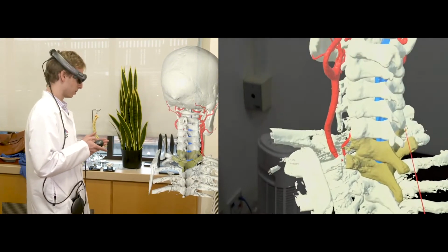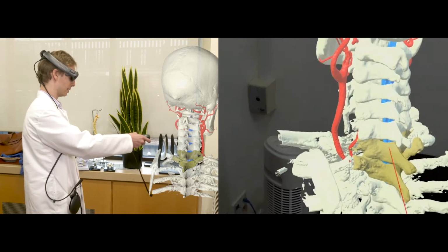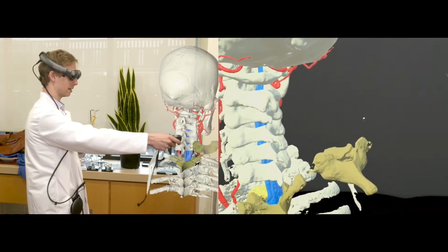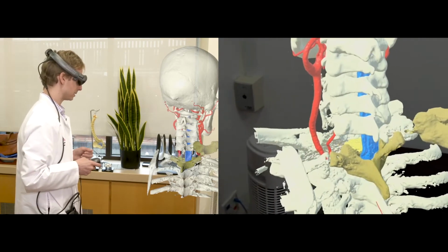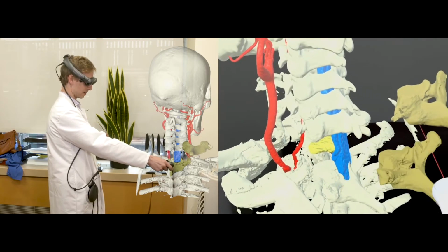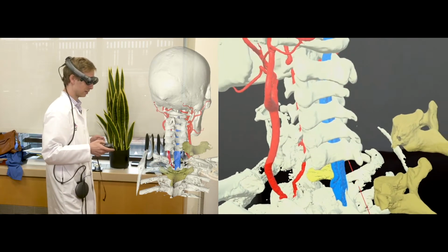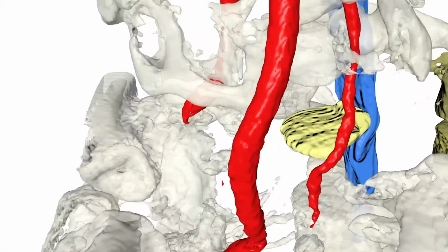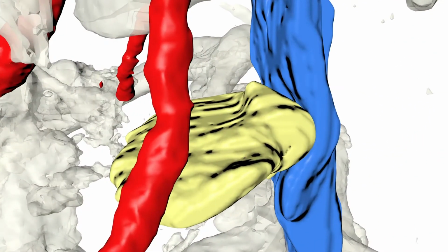And I can come all the way in. I can even pull a spinal vertebral body away and move it around in space. I can take the other spinous process and lamina away, and I can look at this patient's herniated disc pushing on their spinal cord.